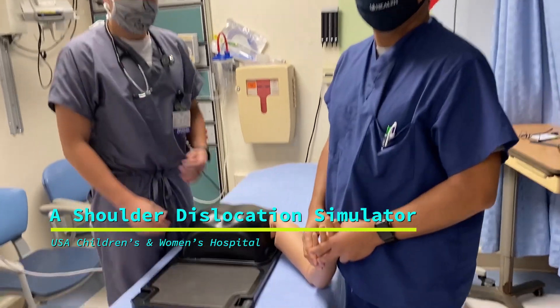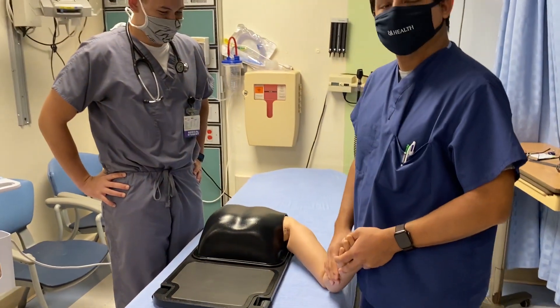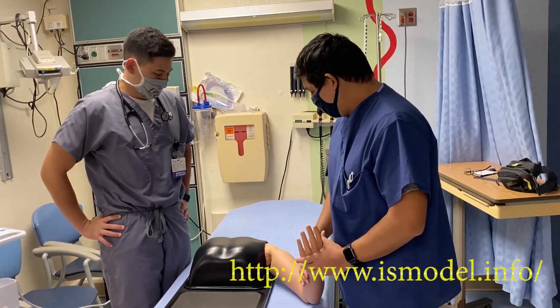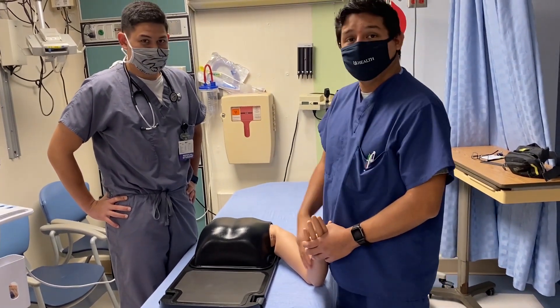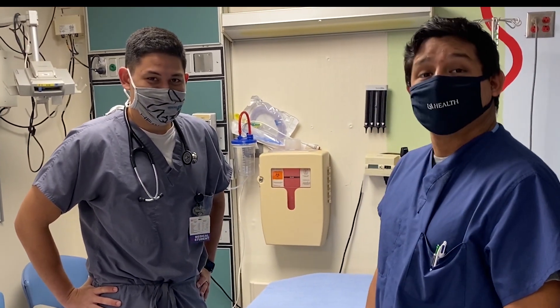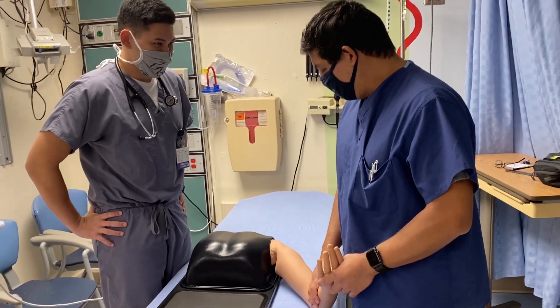We have a shoulder dislocation simulator here that was sent to us, and we're going to try it out and see how many different shoulder dislocation procedures we can accomplish. We have Justin Raphael, one of the emergency medicine residents, and a future emergency medicine resident as well.